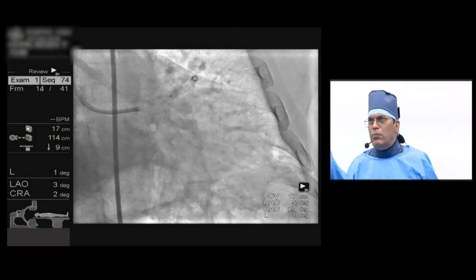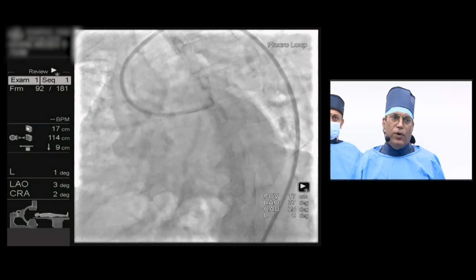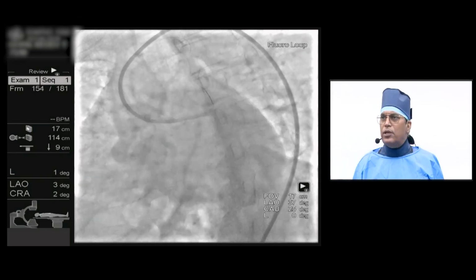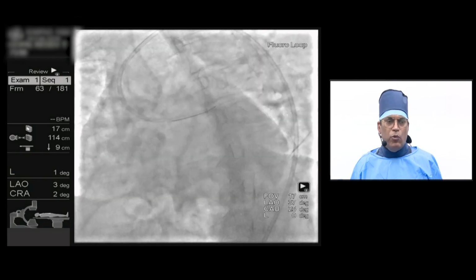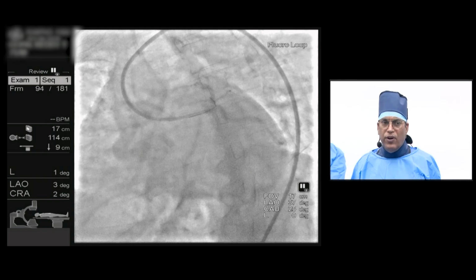We have only one bar, the 1.25 bar, which can be used at 80,000 or 120,000. As per standard guidelines, it is better to use only 80,000 revolutions per minute, with slow movement of the bar, that is 1 mm per second, very slow movement. That's the reason the complication rate is low with 80,000 and slow movement, during forward and backward motion, because forward flow is also maintained and slow flow is less.